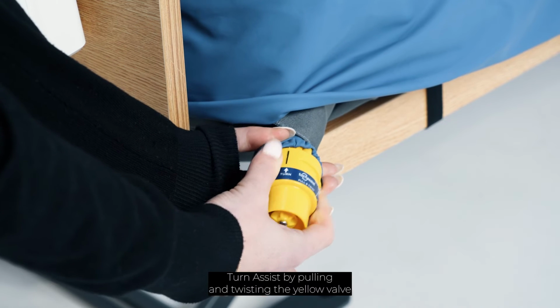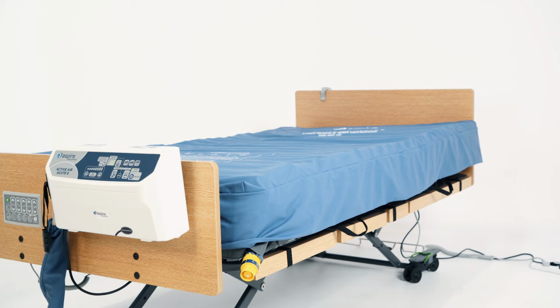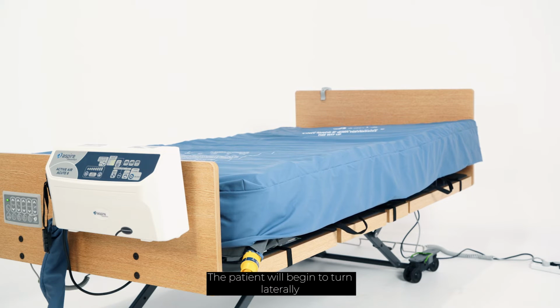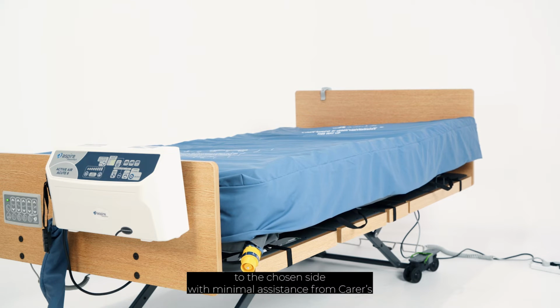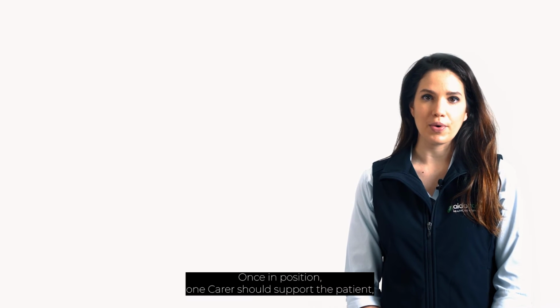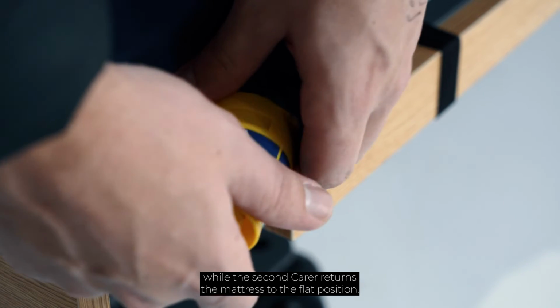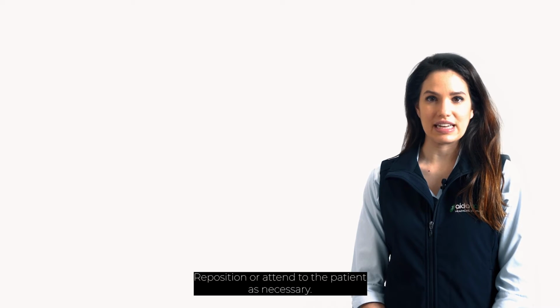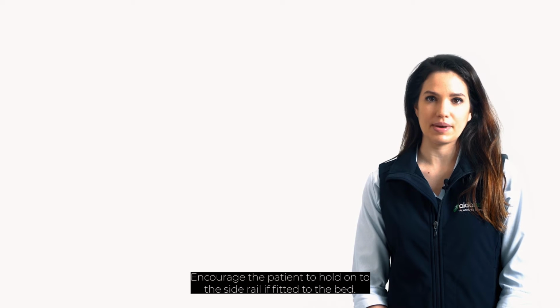Then initiate turn assist by pulling and twisting the yellow valve on the desired side of the bed to the turn position. The patient will begin to turn laterally to the chosen side with minimal assistance from carers. Once in position, one carer should support the patient while the second carer returns the mattress to the flat position. Reposition or attend to the patient as necessary. Encourage the patient to hold on to the side rail if fitted to the bed.